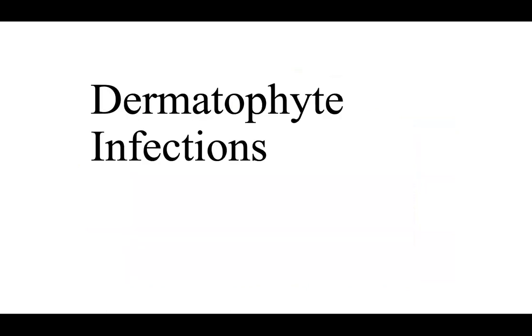Just a brief word on dermatophyte infections. Dermatophyte infections can cause a spongiotic dermatitis. Unless you really are able to visualize the hyphae on histology, which can be really difficult sometimes, especially if you don't have a ton of organisms, but you have enough to cause disease, then you're going to have to do a stain to really rule it out.